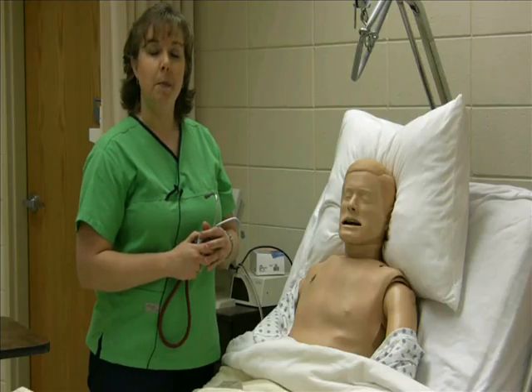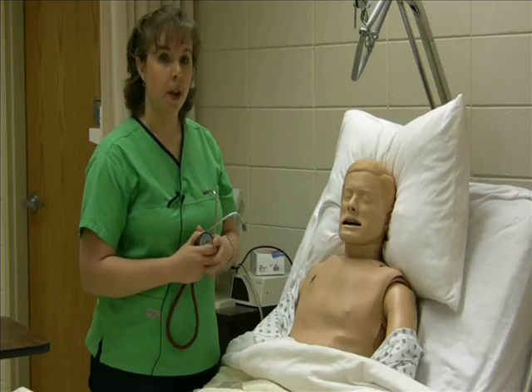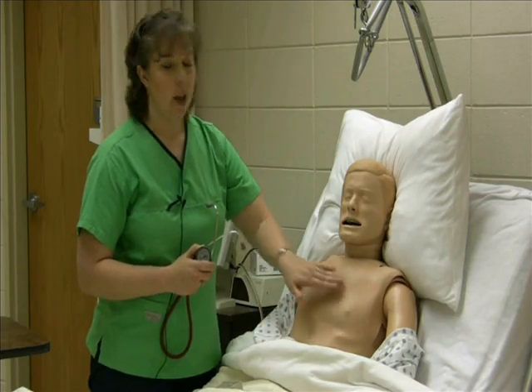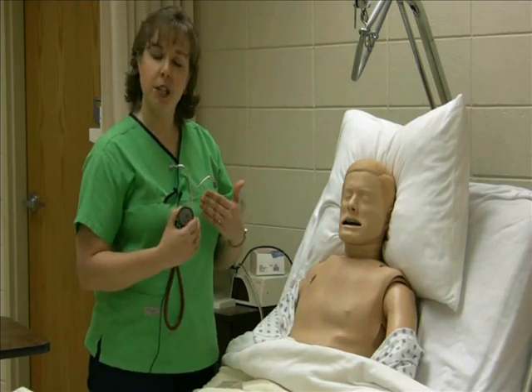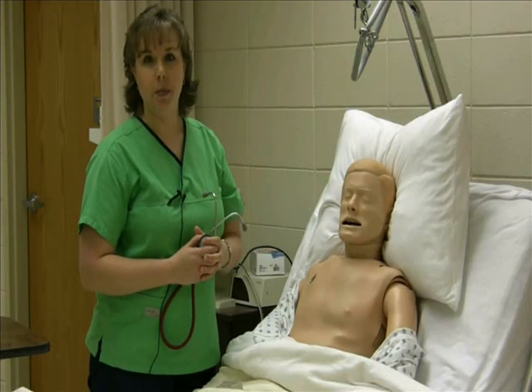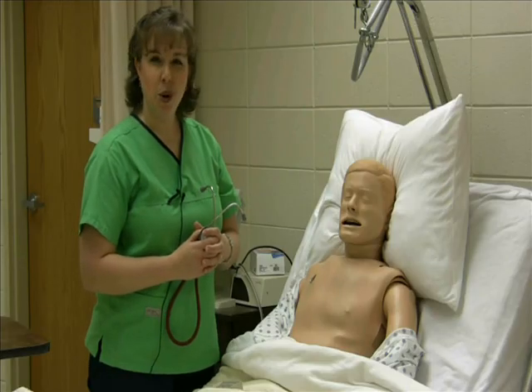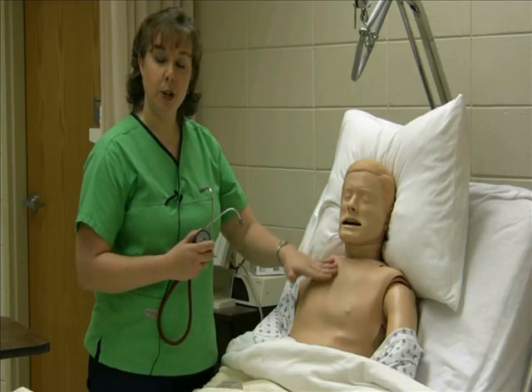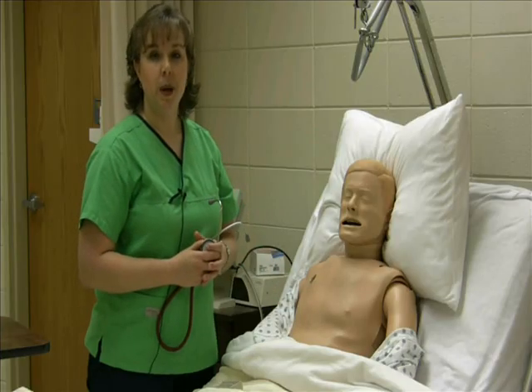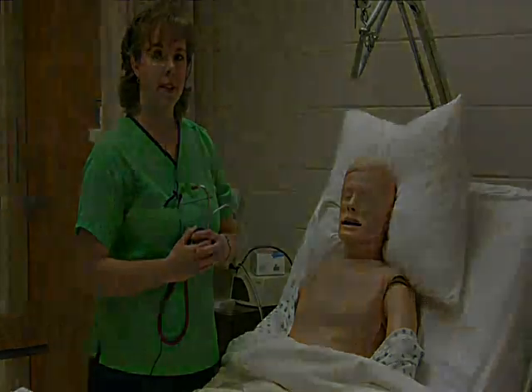If your patient is being monitored, occasionally patients will have what we call a telemetry monitor on them, and they will have 5 patches on their chest, which their heart rate is being monitored by a telemetry machine, and you're able to record their strip. If the person has a telemetry monitor on, it's going to be very important that you note the rhythm, rate, and interpret that strip as frequently as policy calls for within the floor or the hospital that patient is in.